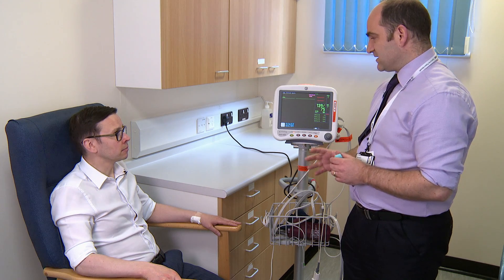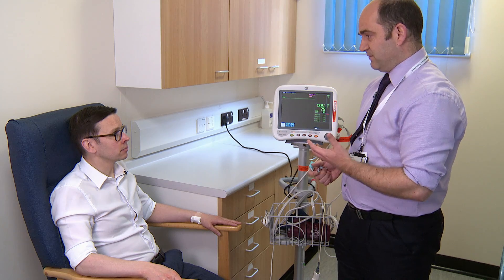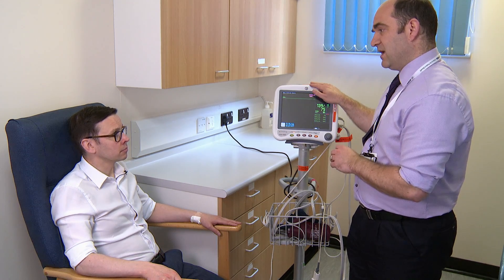So what we're going to do in a second, I'm going to give you a mouthpiece to hold on to. You're going to be breathing that 15% oxygen. I'm going to be monitoring your oxygen levels on here and making sure everything's okay. During the test, if your oxygen levels drop to a level where we're unhappy, we'll stop the test there and the likelihood is that you will need to take oxygen on the flight.